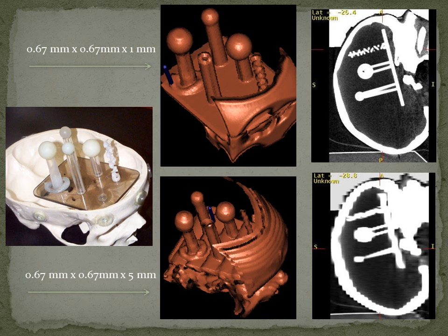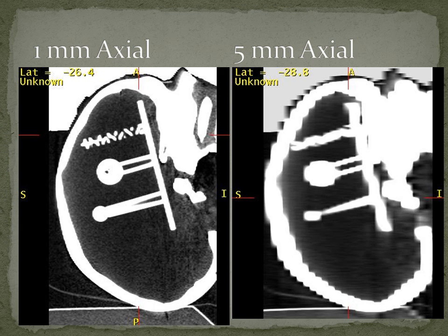And here it is with 5 millimeter resolution. If I showed you the actual slice itself, the in-plane slice looks better. But when you actually try to reconstruct, you no longer know where things are. And so you've, again, got to be very careful about it. Again, just the two showing the difference between those two resolutions.